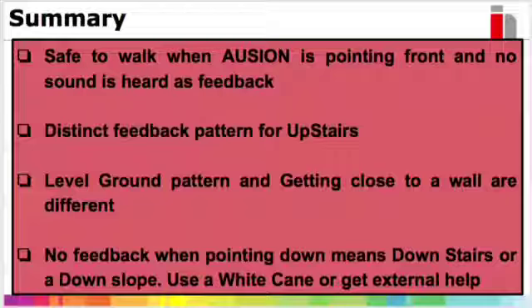Let us summarize. When AUSION is pointing to the front and you do not hear any musical note as feedback, it is safe to move forward. When you get a very distinct musical pattern as you point to the ground, you are close to an upstairs. You can find the side railings and climb safely. This pattern is like this.